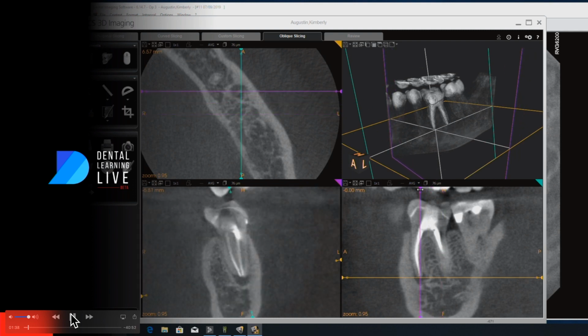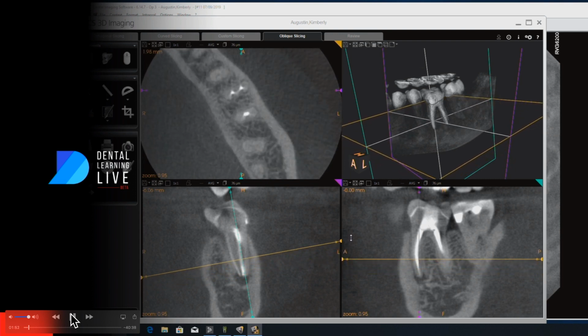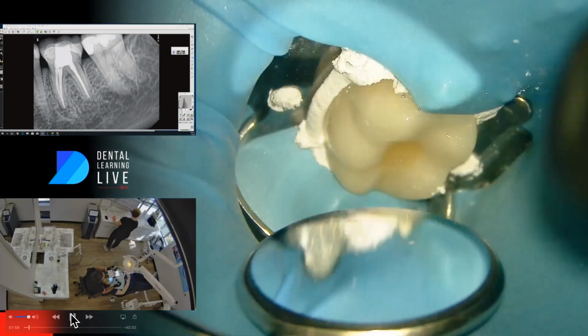So let's line this up here, and then we'll appreciate how broad they spread apart. All right, so let's begin.